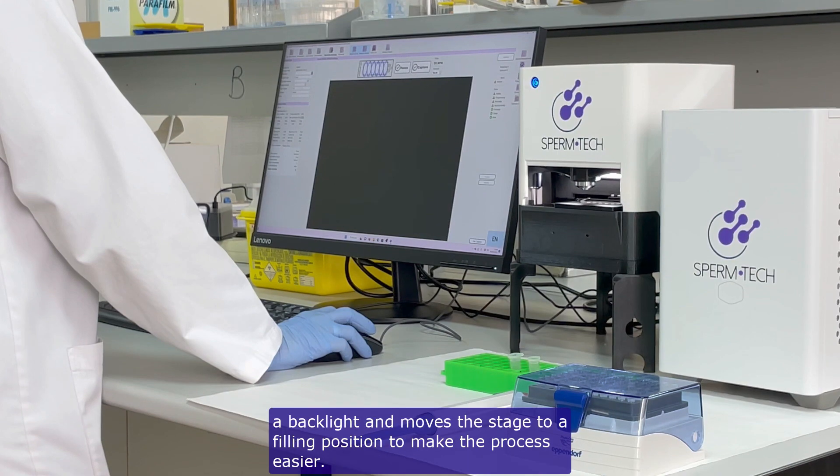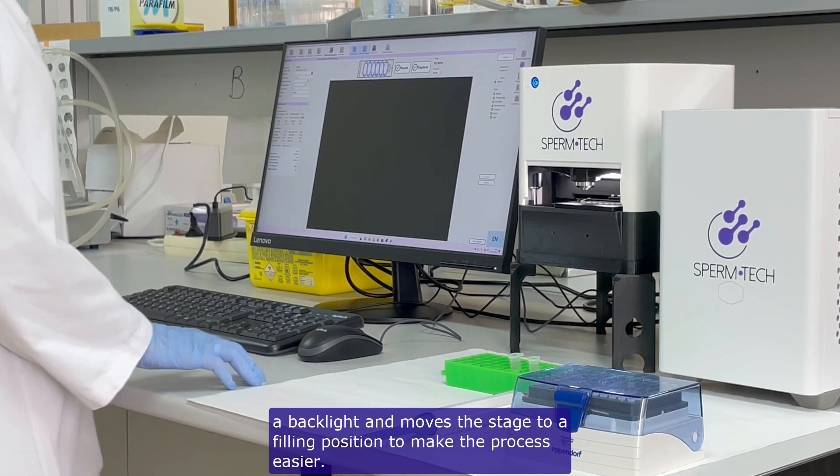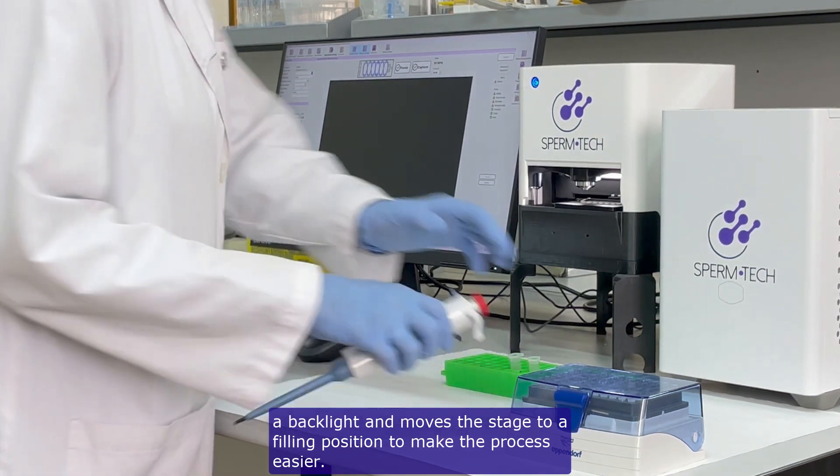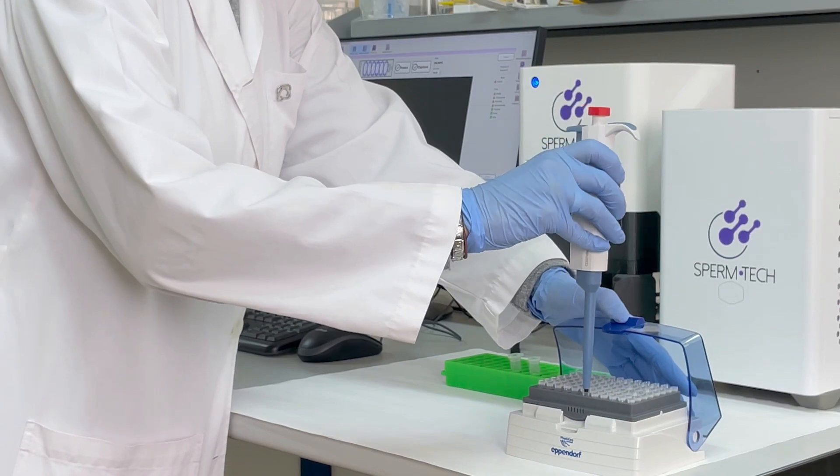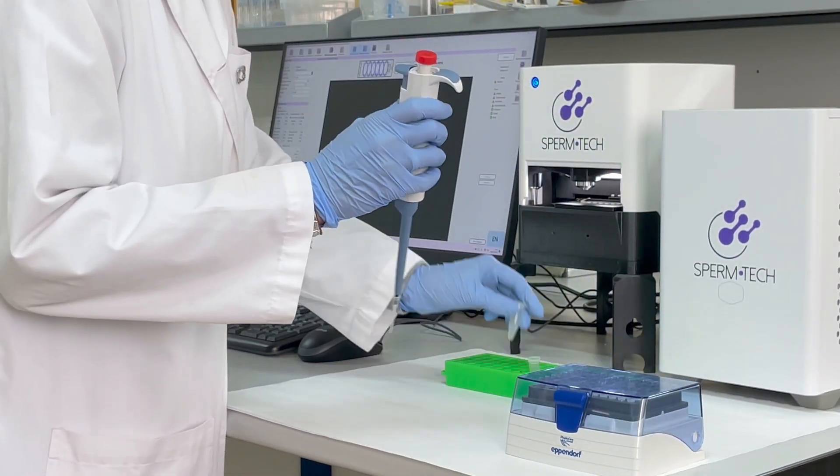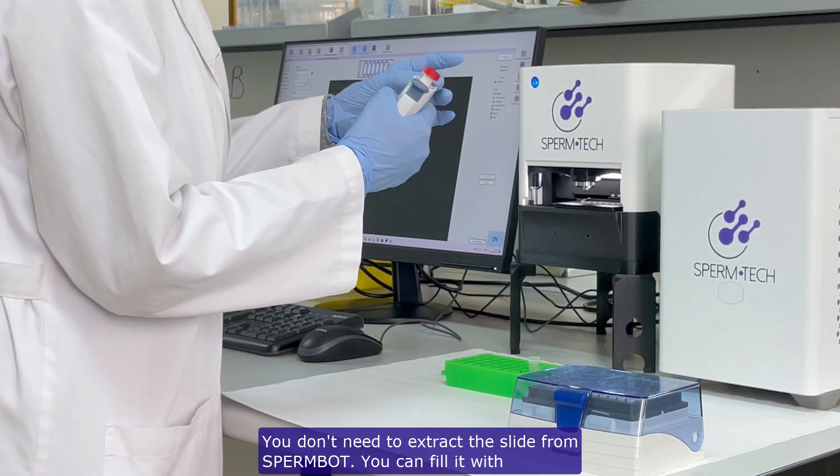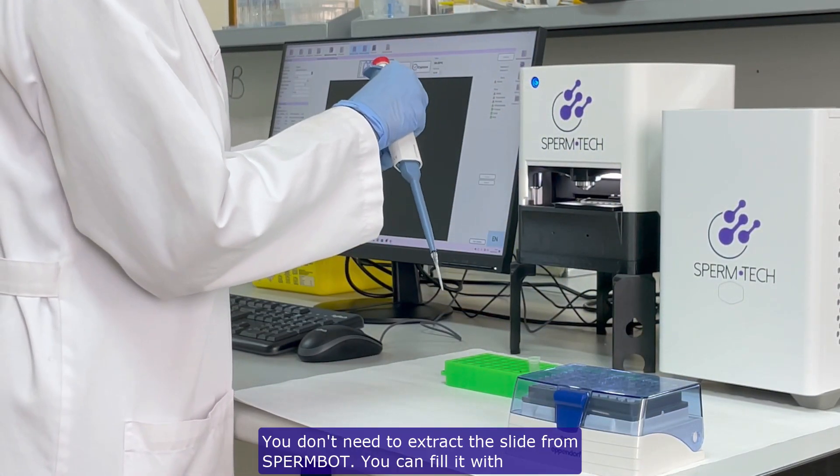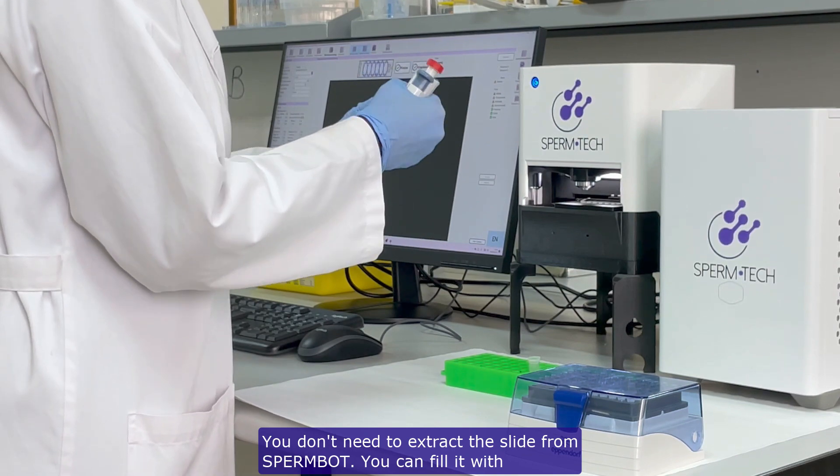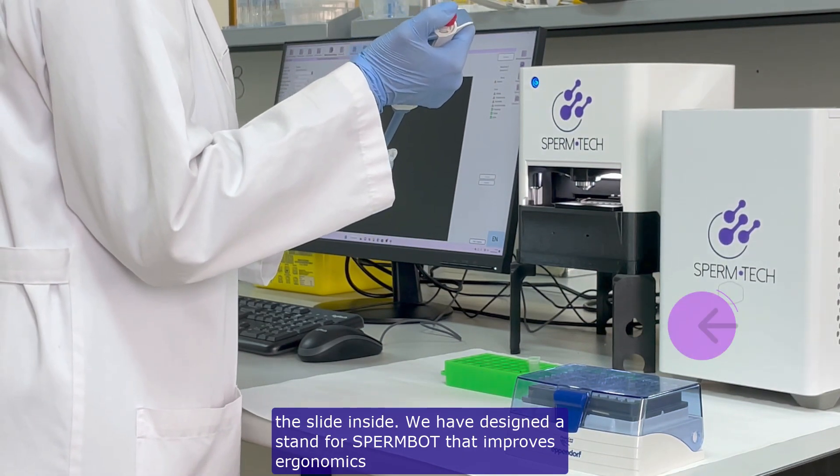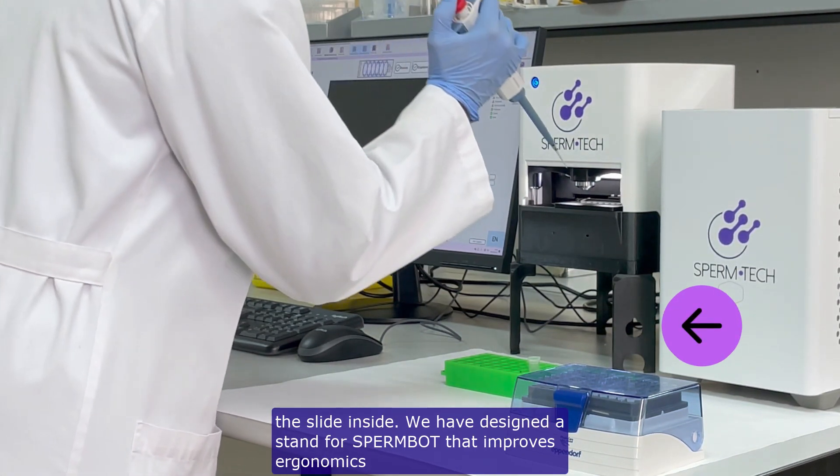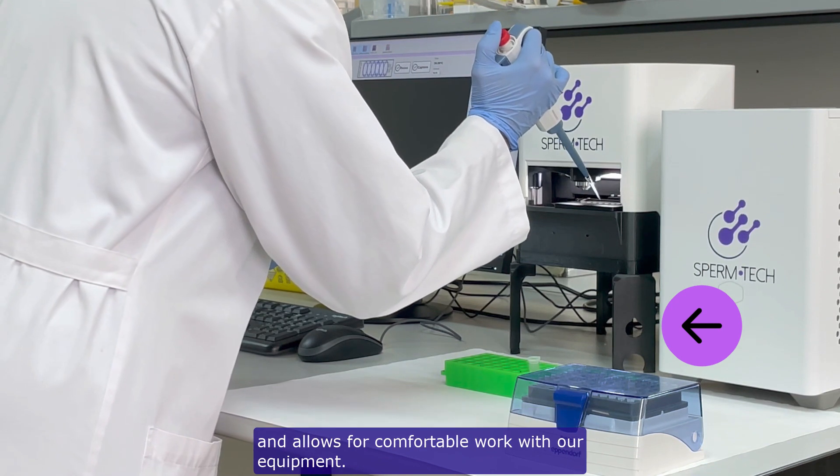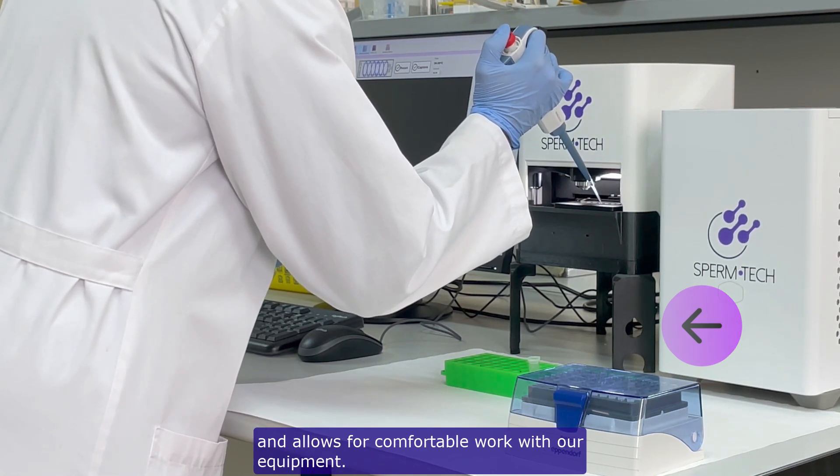Spermbot switches on a backlight and moves the stage to a filling position to make the process easier. You don't need to extract the slide from Spermbot. You can fill it with the slide inside. We have designed a stand for Spermbot that improves ergonomics and allows for comfortable work with our equipment.